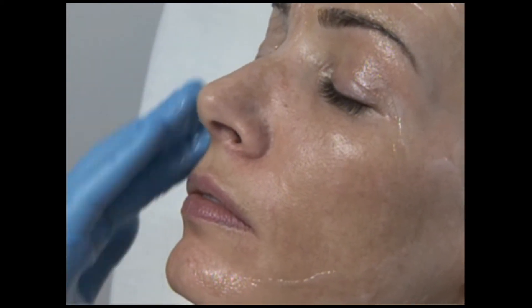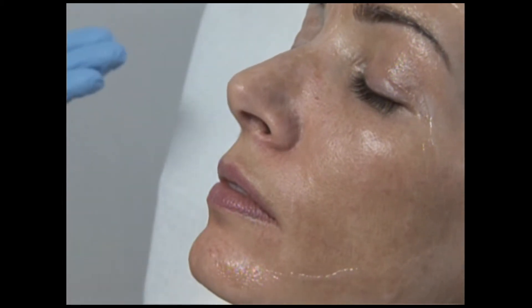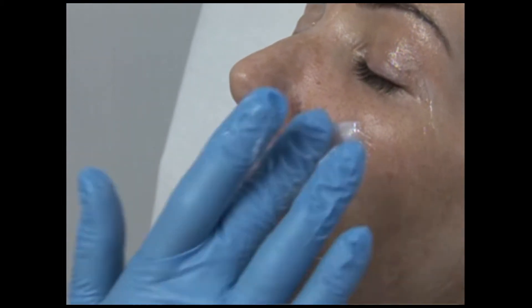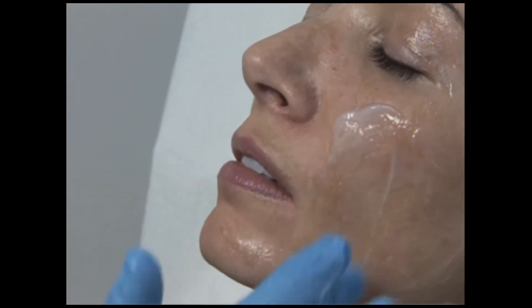There are external eye shields and also internal eye shields. If we put the internal ones in, we'll put some numbing drops in your eyes as well, and then they're really easy to get in. We do that pretty often.